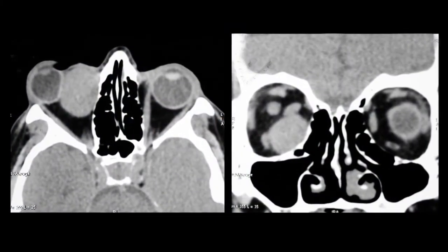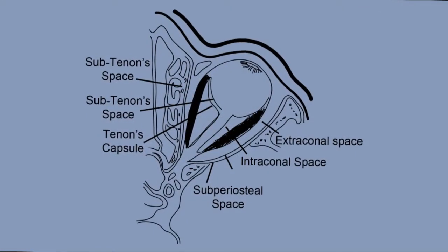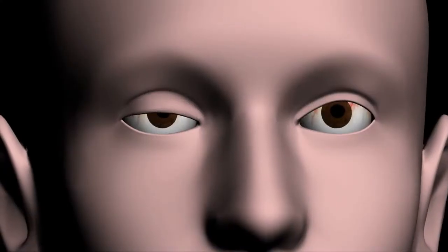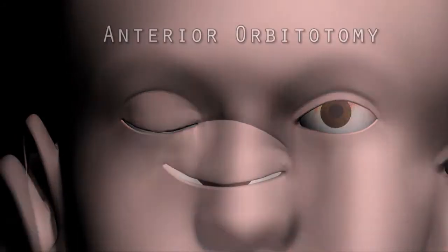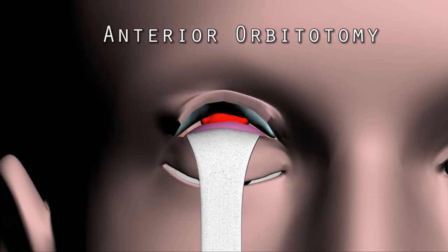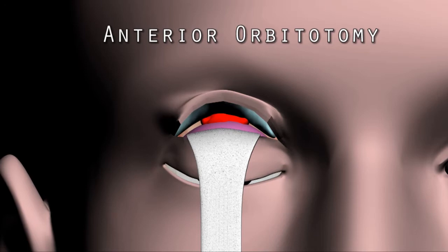Complete surgical excision remains the primary treatment of choice for well-defined clinically benign orbital tumors. Orbitotomy provides access to surgical spaces in the orbit. Each orbitotomy technique is designed to provide the best surgical exposure to the lesion of interest while causing least damage to the orbital structures, with a goal to achieve optimal functional and cosmetic outcome.